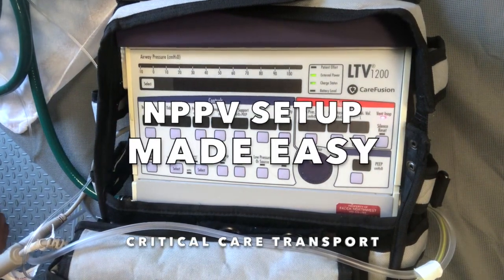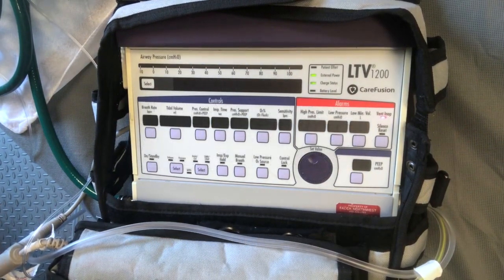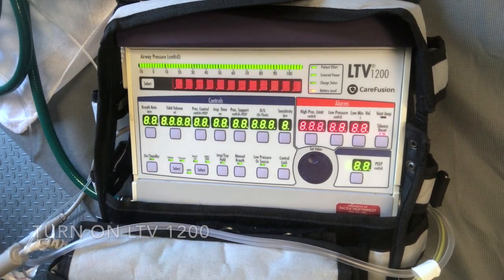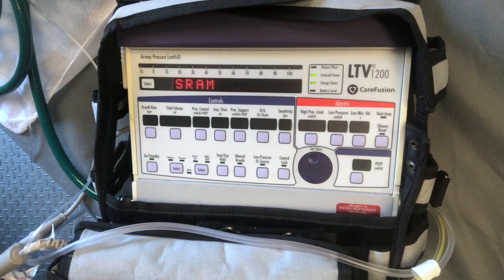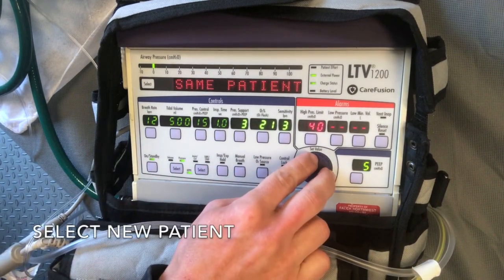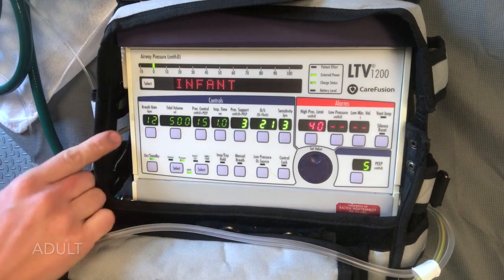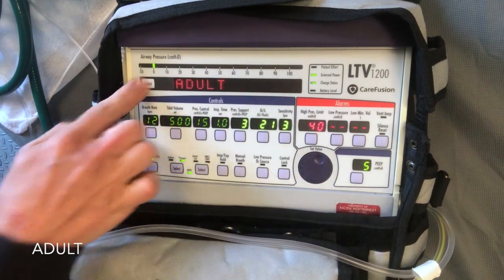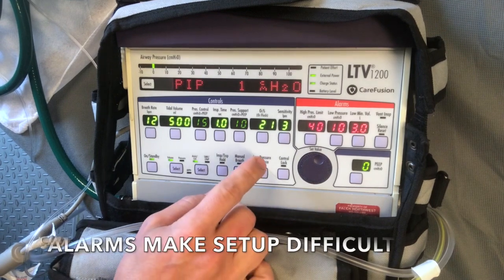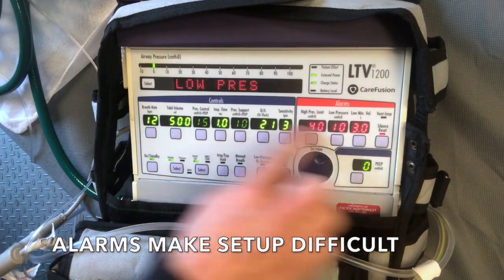Getting into NPPV mode on the LTV1200 is kind of a nightmare, but I'll show you the easy way to do it. First, turn on the LTV1200. Now select New Patient and select Adult. Now the underlying reason why it's so difficult to get into NPPV is because of the alarms.